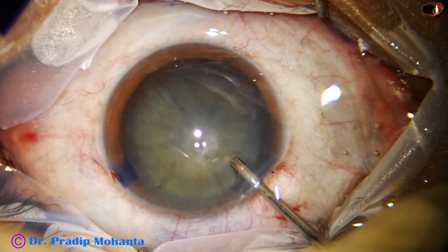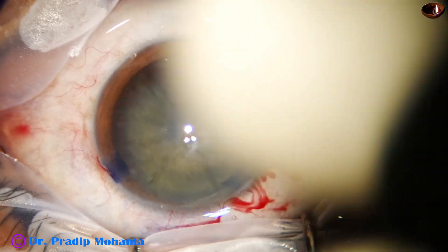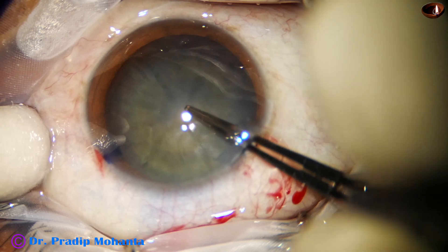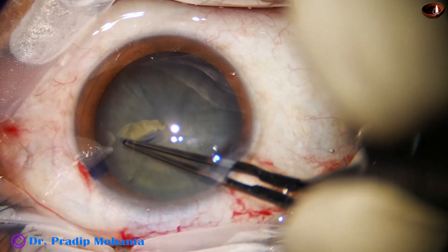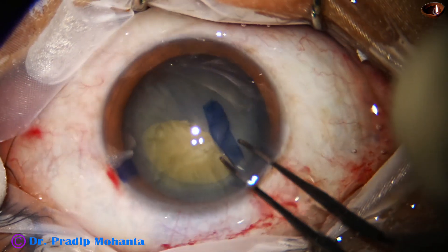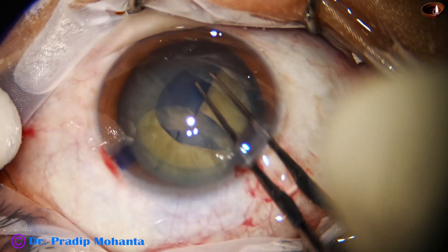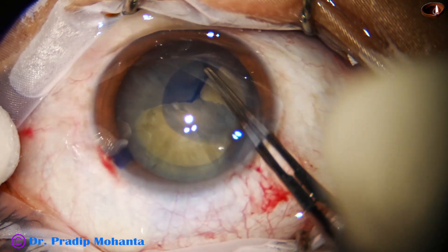The anterior capsule has been stained with trypan blue dye, the anterior chamber is filled up with viscoelastic, and now capsulorhexis is being done with a Utrata forceps. A capsular tag is raised by the tip of the Utrata forceps and guided all around to get an adequate-sized capsulorhexis.